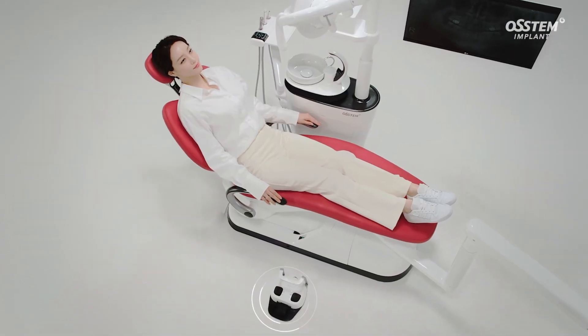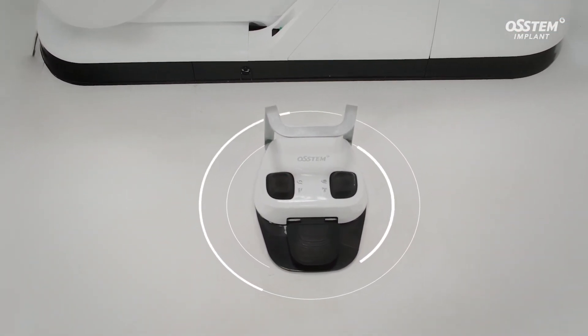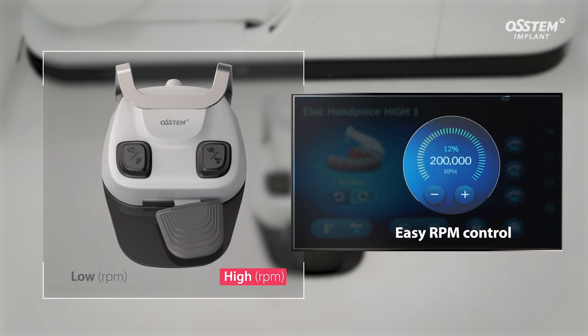The K5 also has a wireless foot controller designed to offer an even more convenient treatment experience for the clinicians. Handpiece RPM can be easily adjusted by turning the foot pedal left and right, making treatment more efficient.